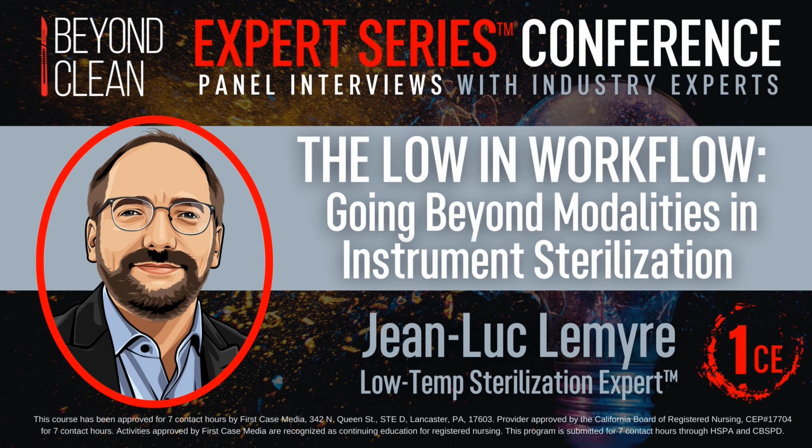Is that reason about hydrogen peroxide spontaneously combusting around paper and cellulose products why low temp sterilizers instruct you not to put any cellulose-based products in there? Like if you had a bunch of paper in there, is that the big risk factor? I think there's different risks there.